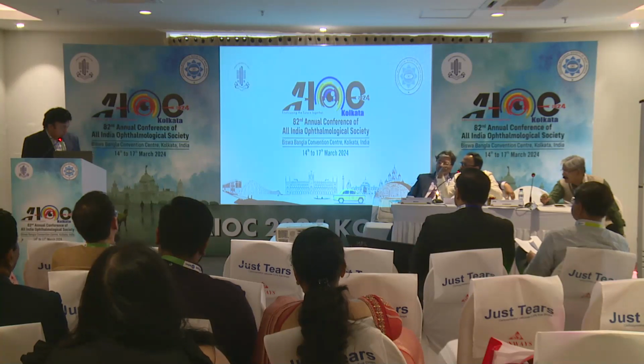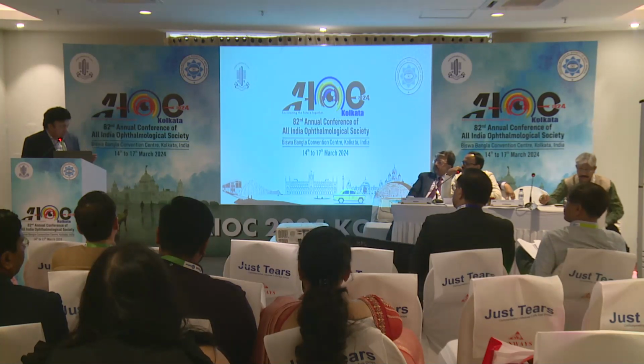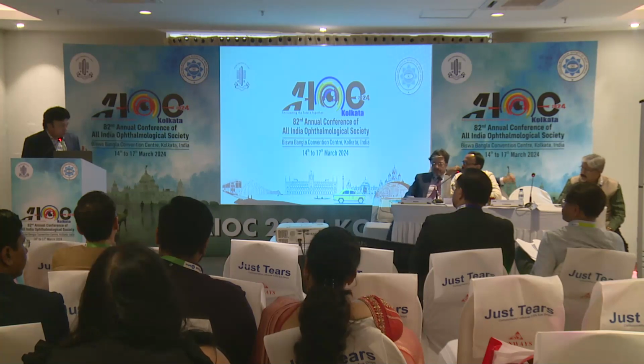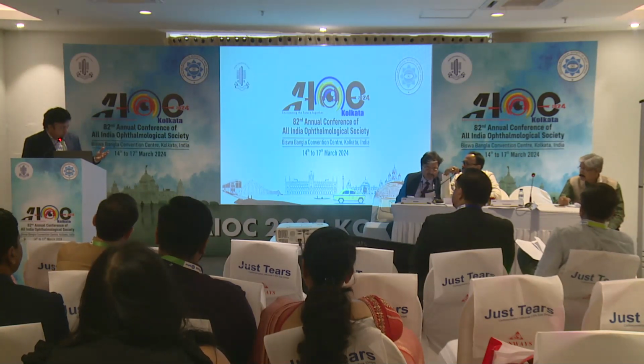Now, did you adjust the distance from the limbus, or did you plan? Yes, 2.25 millimeters. We have slowly discovered that with that distance in an adult eye, there is no pupillary capture, and this is as good as putting it in the bag.